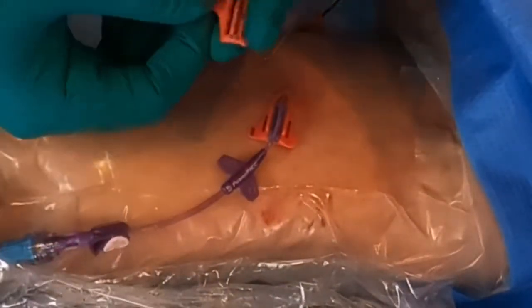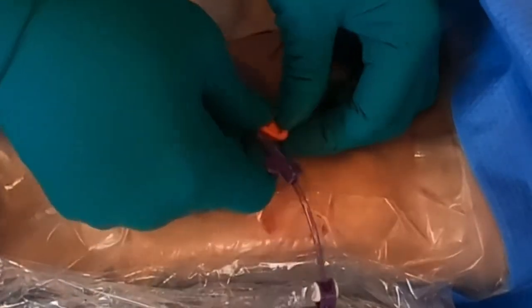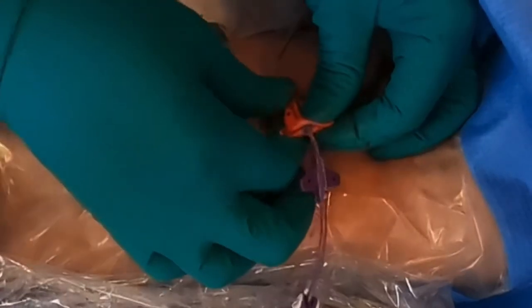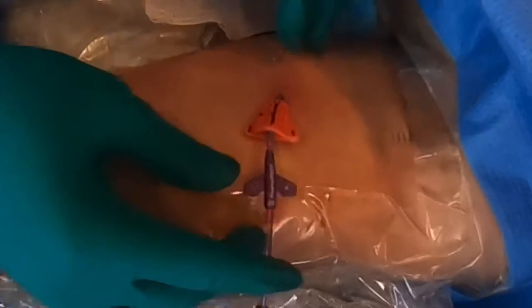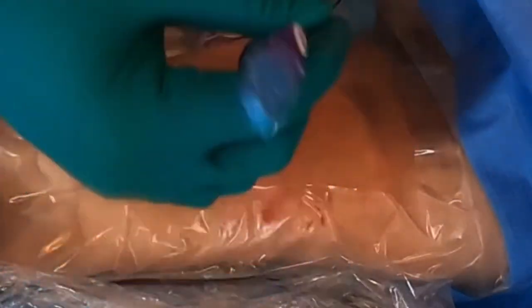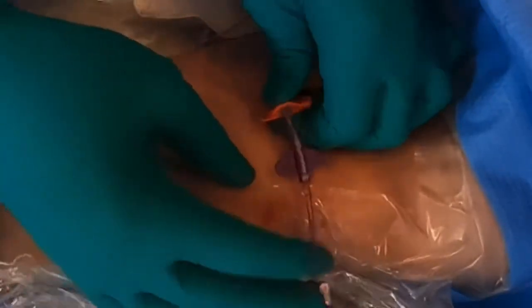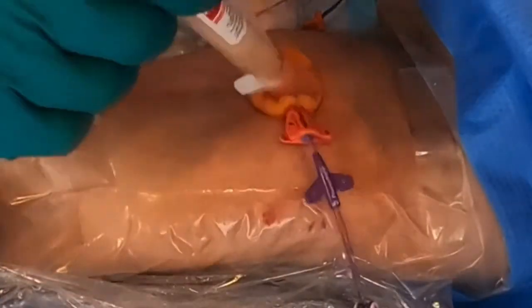Let's put it on — try to cap this together. Look at that — no sutures, no need for sutures. It's just excessive holes in the body that we don't need. There we go. Now it's going to be super easy to change his dressing. Is there any pain here? No. Feel that click? Now it's nice and closed. This decreases risk for infection.